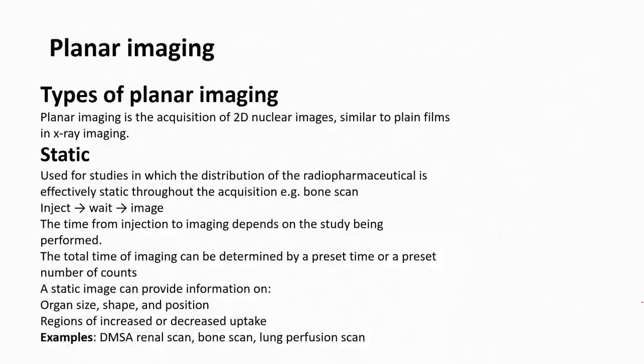We just finished discussing the topic of filters and the role of this discussion in our work. We take some simple points. We mentioned that there are two types of imaging, planar and SPECT. For example, if you want to take a picture, you inject the patient with a dose. You want to see the thyroid, you want to see the kidneys, and you want to take an anterior image.